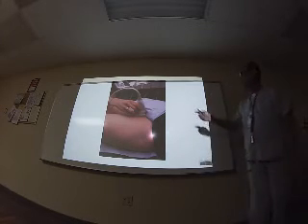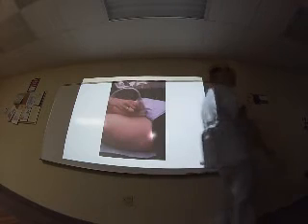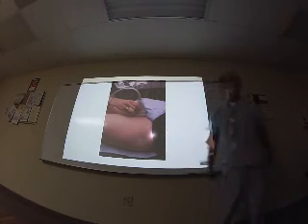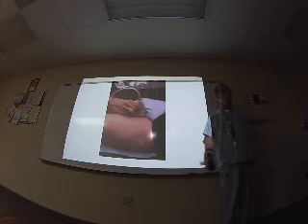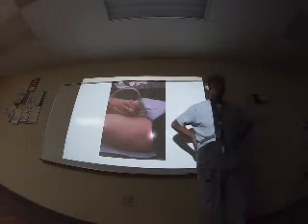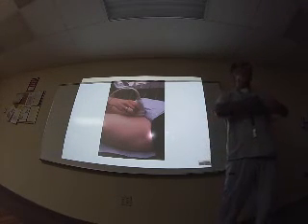It's very important. Okay, this is to scan the common femoral artery. This is the area. Okay, this is a transducer. This is a linear switched transducer and a frequency around, how many megahertz? 7.5, high frequency, low penetration, good quality. High frequency, 7 megahertz, good quality, but no penetration. You cannot use this transducer if you are going to scan the kidney, because the kidney is too deep. What transducer do we use for the kidney? 3.5, convex switched.